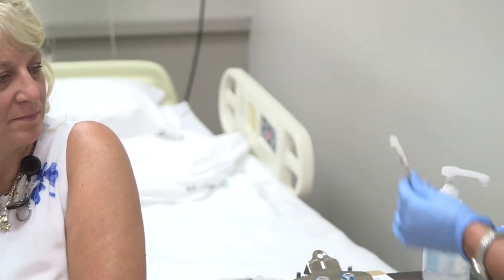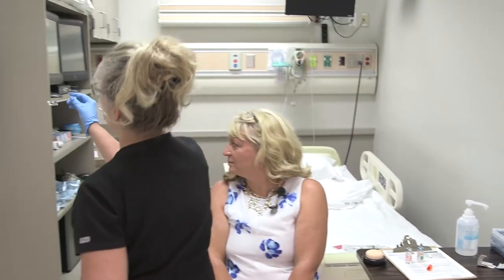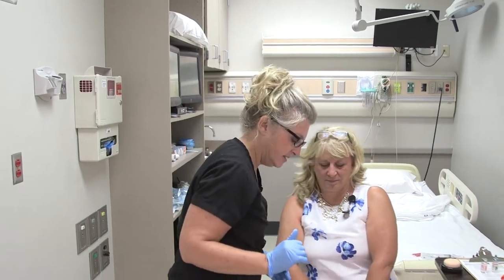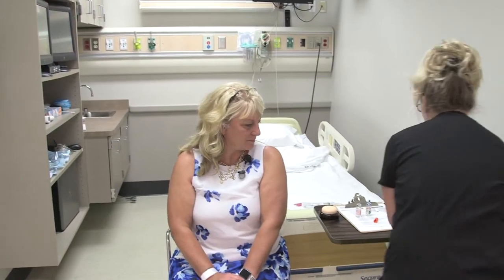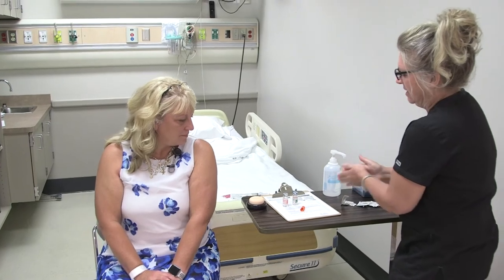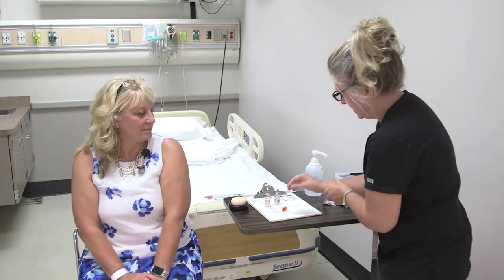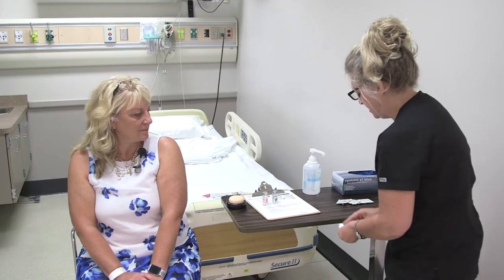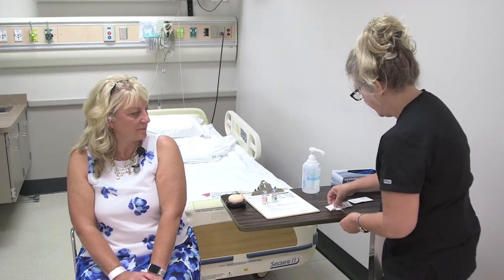We're going to put our safety cap on and dispose of it in the sharps container before we do anything else. Then remove our gloves, wash our hands, and we've completed that. We have to document the site, the amount, the dose, and the time, and make sure we sign that.